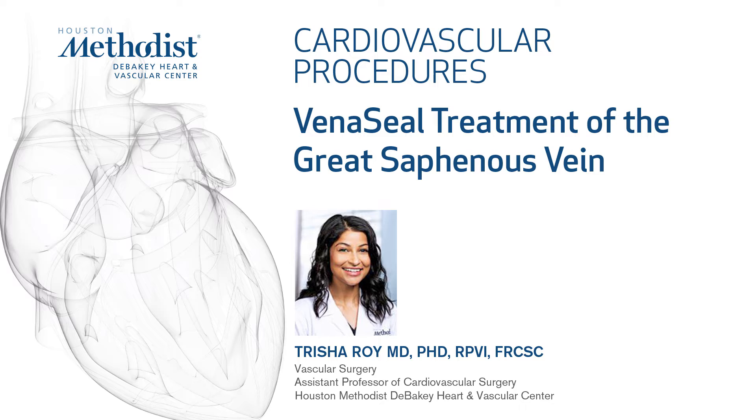My name is Trisha Roy. I'm a vascular surgeon at Houston Methodist, and this video will demonstrate endovenous treatment of the great saphenous vein with cyanoacrylate glue, or the trade name is VenaSeal.